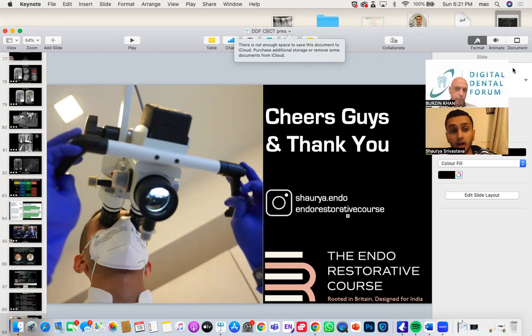It's not a root canal filling, but something like a magic mix which totally discolors your pulp chamber and your canal space. So I've taken an intra-op scan for that as well, but I don't think I've taken an intra-op scan more than 7, 8 times. In all honesty, the indications for that are very, very low, and it's also a matter of having that machine at your disposal, whether you take that option or not. So that's a matter of convenience, which is unfortunately not available for everybody.